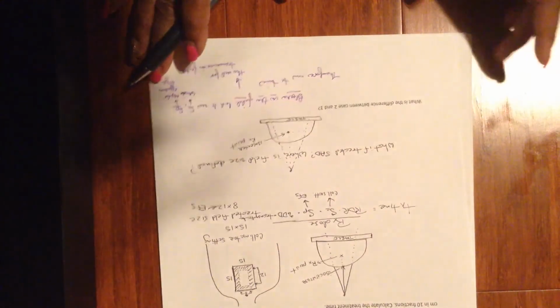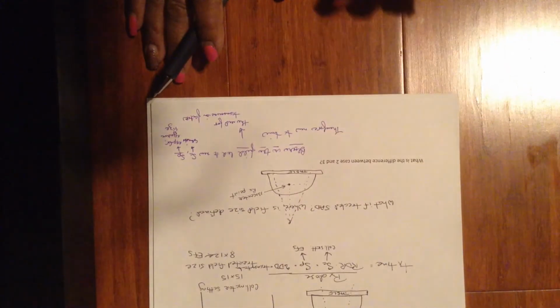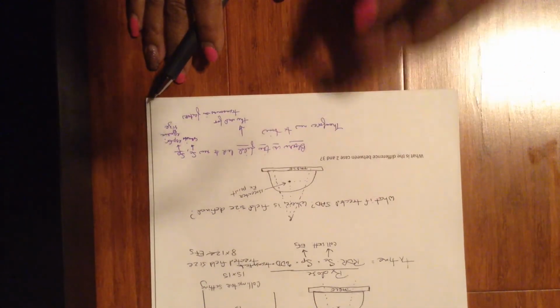Okay, I'm going to do another video where we can go through field size definition and the difference between SSD and SAD technique.